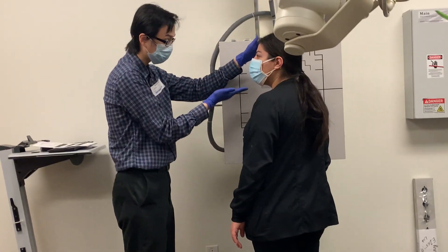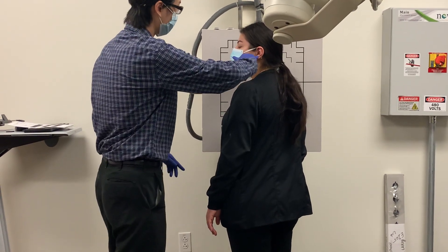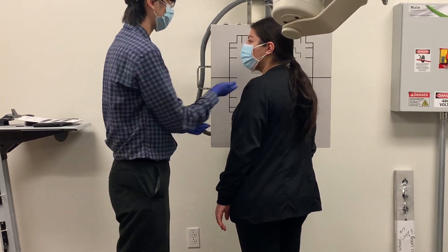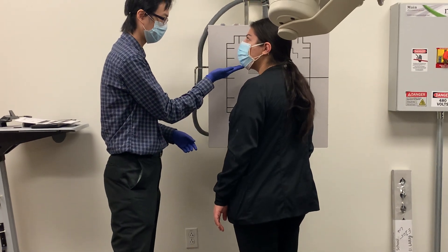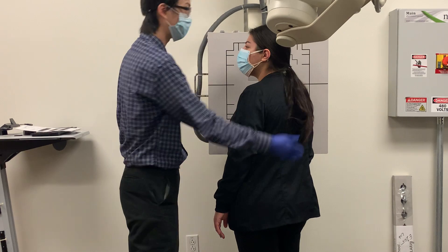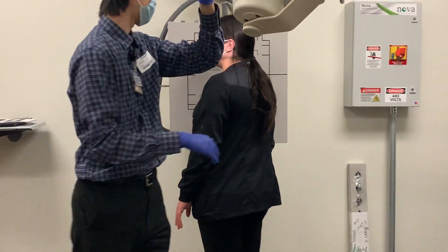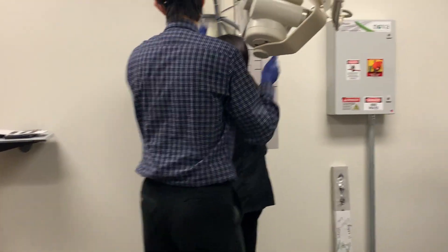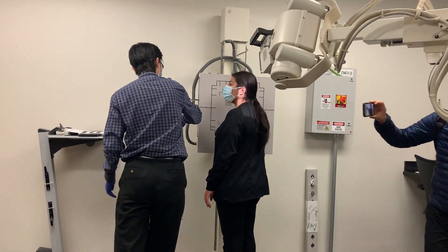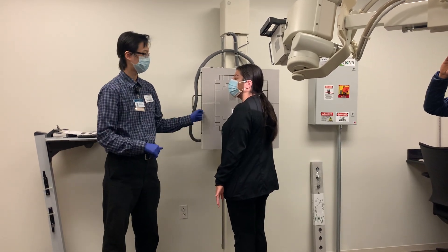Very good. Lift the chin up just slightly. Just like on our lateral, we're trying to line up. Lift up slightly. So, 45-degree oblique down here at the body, lateral up here at the head. And this time, 15 to 20 degrees, we're angling down for the anterior oblique.